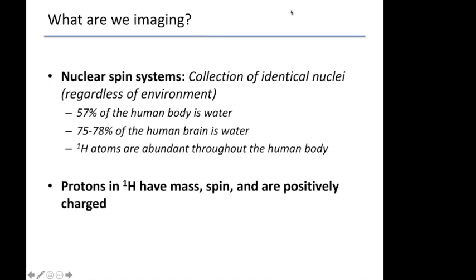So what are we imaging when we use MRI to image the brain? Really what we're imaging is water. As Jay mentioned, you're magnetizing water, using the MRI as an incredible receiver of radio frequency signals manipulated by an incredibly large magnet.